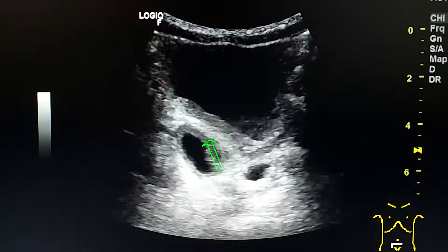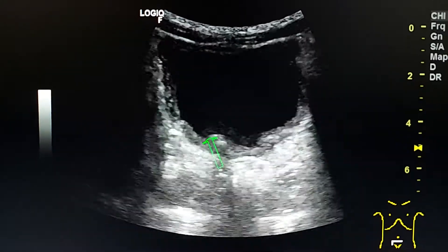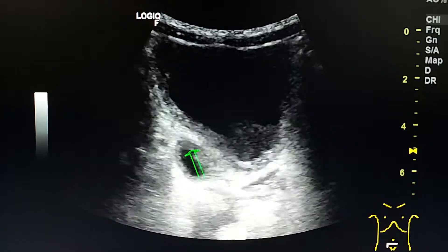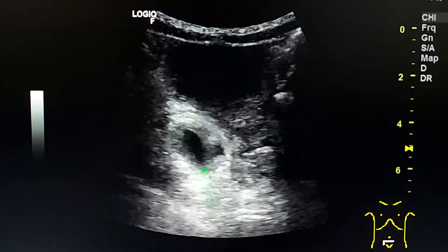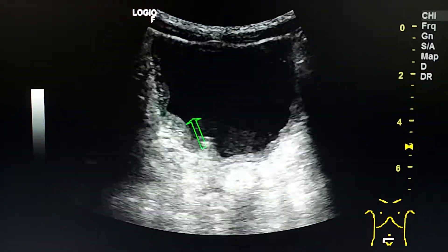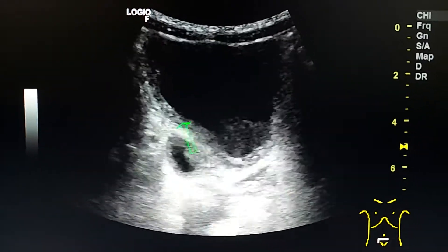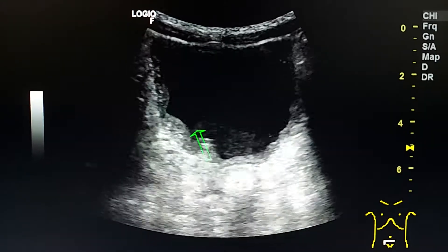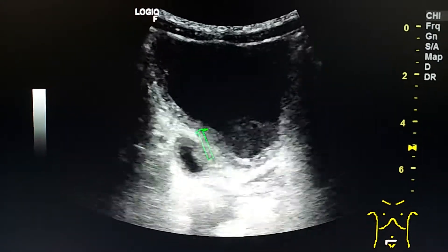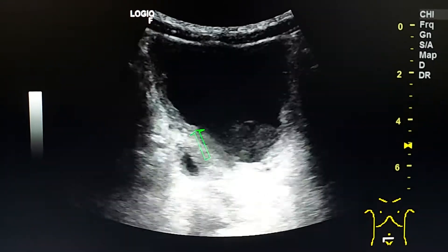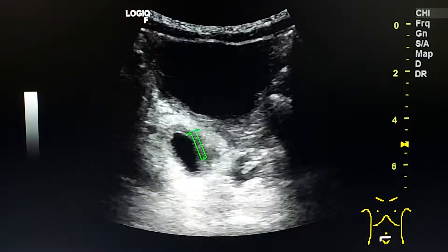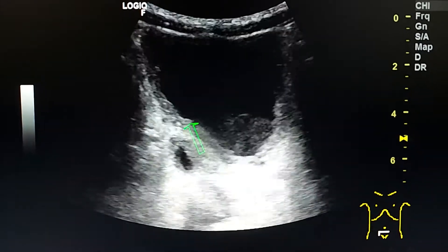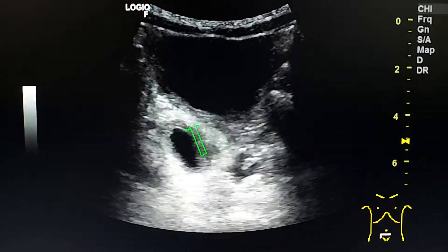It has the same wall — the wall is like the wall of the urinary bladder. It is a diverticulum from the posterior wall.